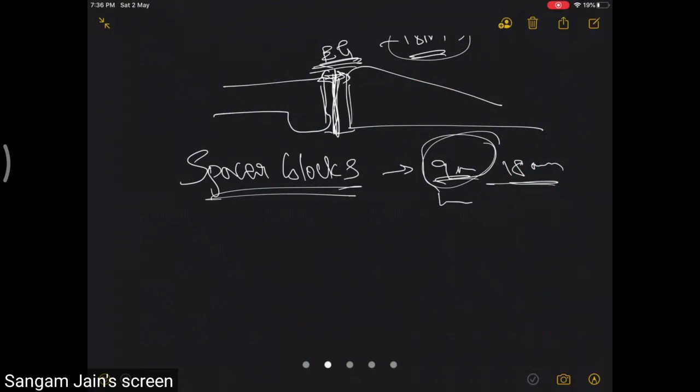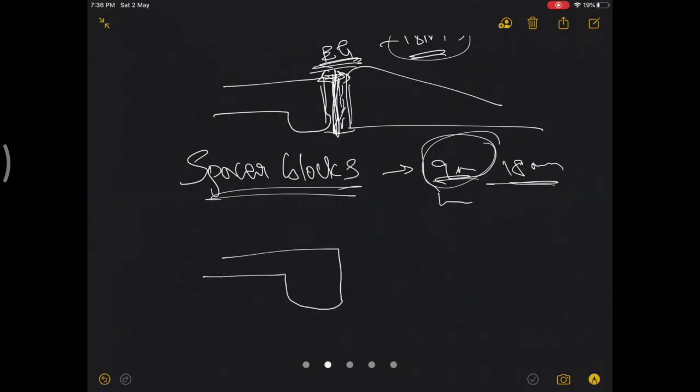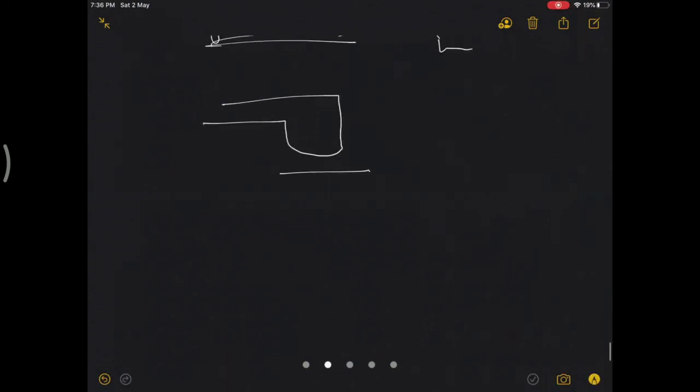You have already taken a 9 mm proximal tibial cut. So you already know that the gap here is 9 mm, and you'll have to have a 9 mm cut from the femur to have a similar or the same flexion gap as the extension gap.